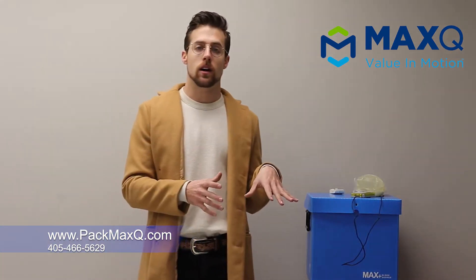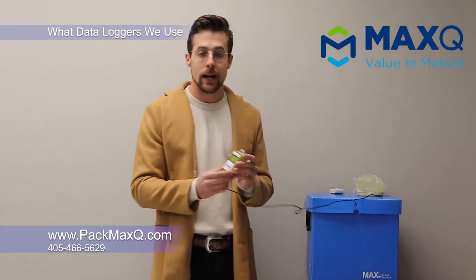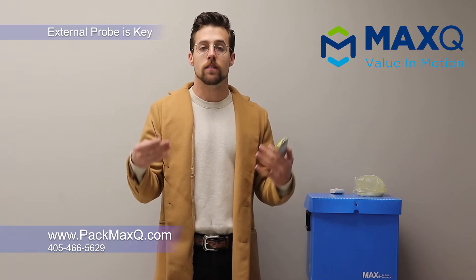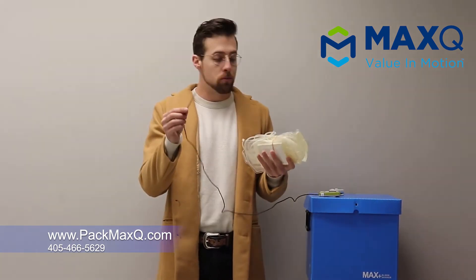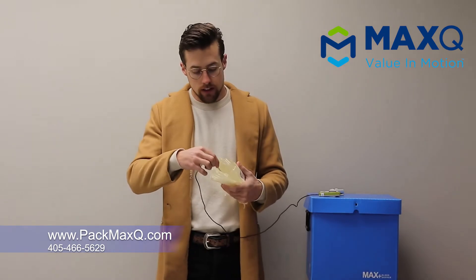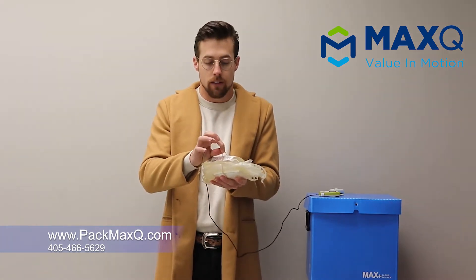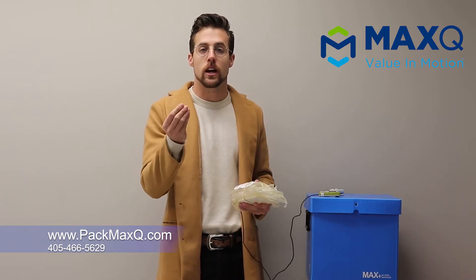Now that you know the sequencing for packing our systems out, we can talk about our data loggers and how we put those loggers into our units. What we use are the i-minis from Cryopak. These are NIST calibrated every year. The great thing about these data loggers is that they come with an external probe. This is the most important part of our validation process — our data loggers have an external probe, and what we do is sandwich this probe between two mock blood units just like this. You can slide the probe between them and fix the two units together with a rubber band or packaging tape, so that those two units are squished together and really hug onto that probe.